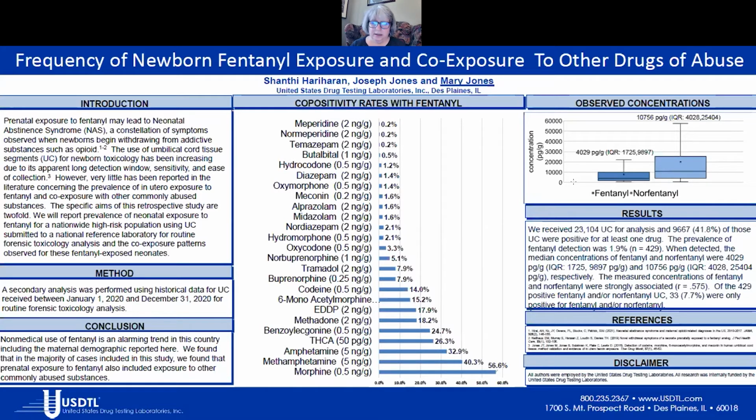So let's talk about our cutoff. A cutoff is the decision point at which we say a sample is positive or negative. If it's below the cutoff, it's negative. If it's above the cutoff, it's positive.